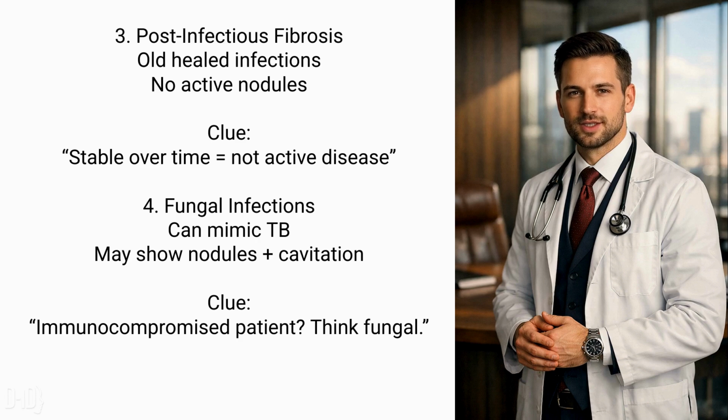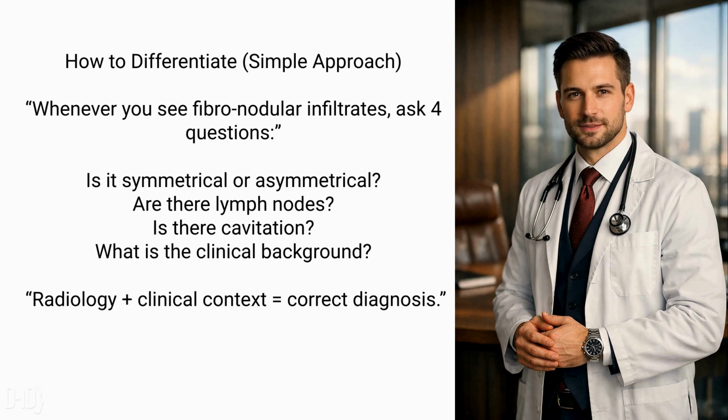4. Fungal infections can mimic TB, and may show nodules plus cavitation. Clue: immunocompromised patient, think fungal. How to differentiate? Simple approach. Whenever you see fibronodular infiltrates, ask 4 questions.